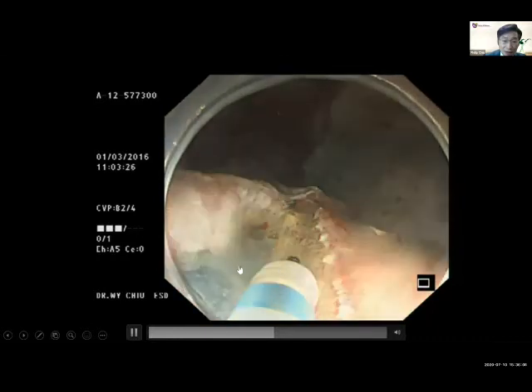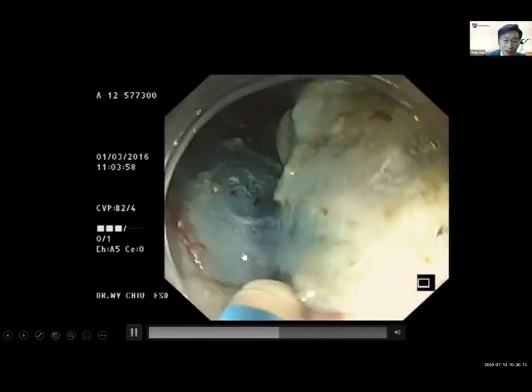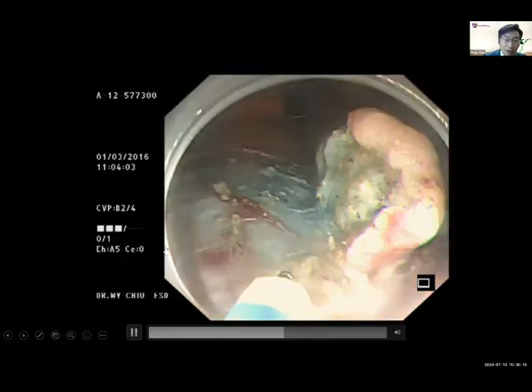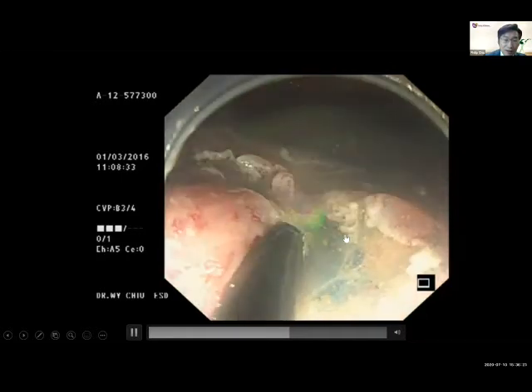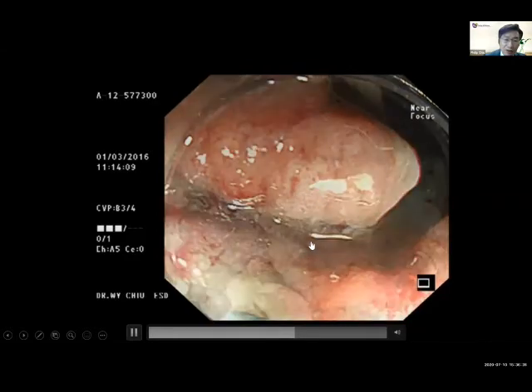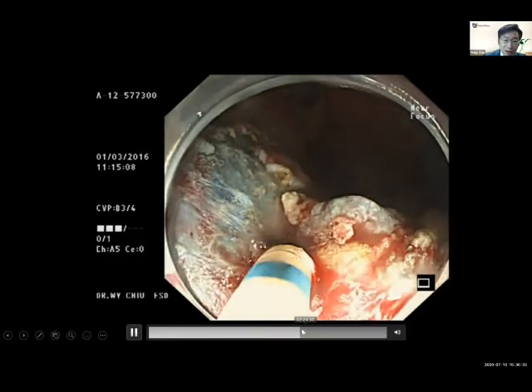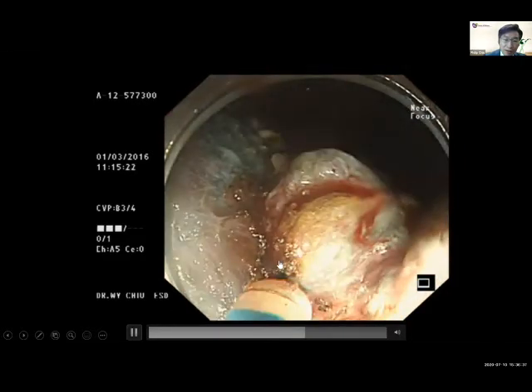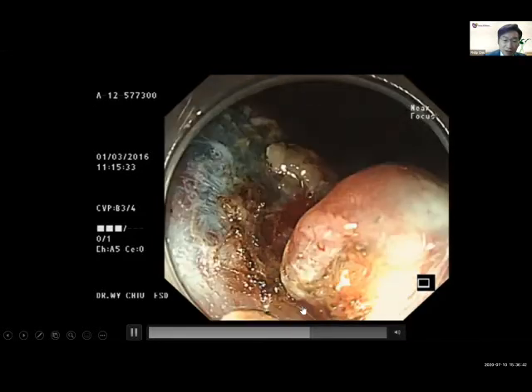One of the difficulties of submucosal dissection is that we do not have another arm or retraction device for us to lift up. So it depends on the cap, the scope, and the technique of the endoscopist to achieve a good lifting effect at the submucosa to avoid a perforation. This lesion happened to be over a previously dissected area, over a previous ESD scar, so there may be some adhesion encountered during the dissection.